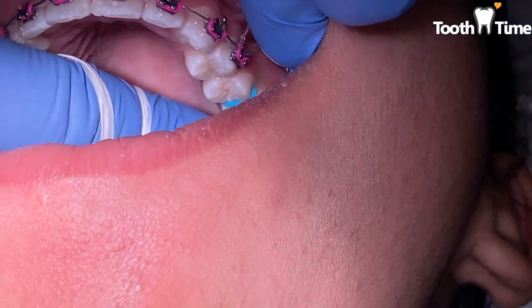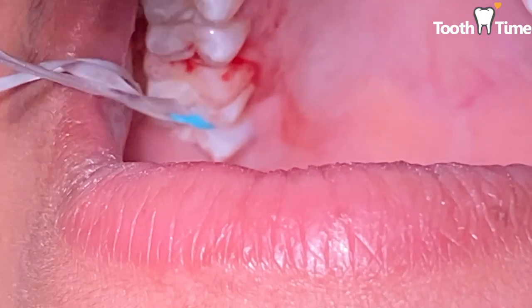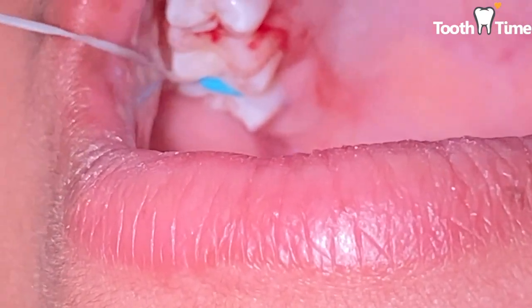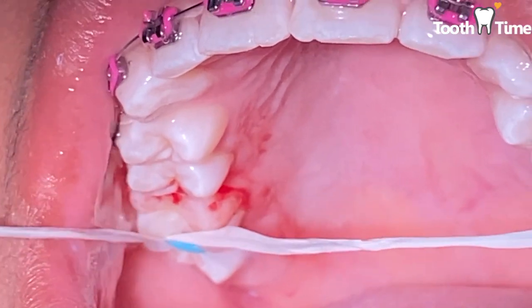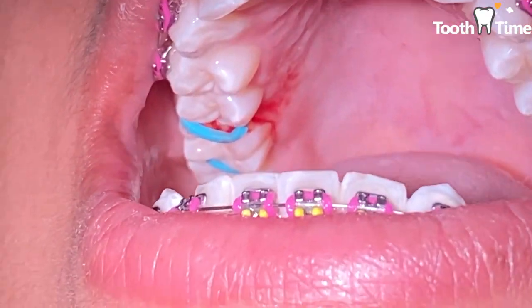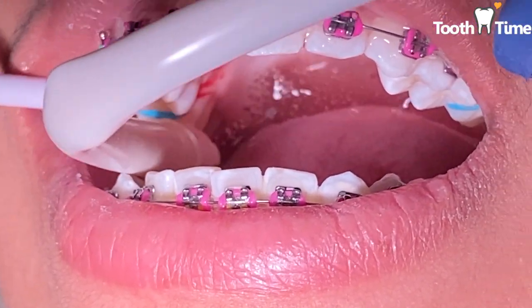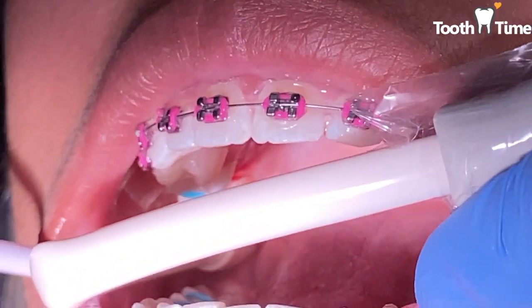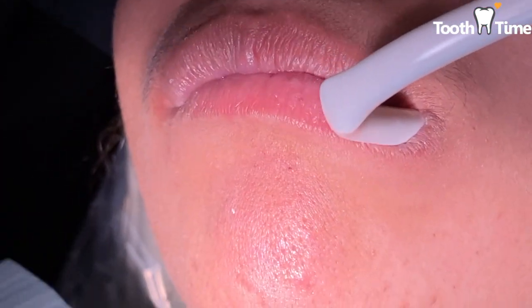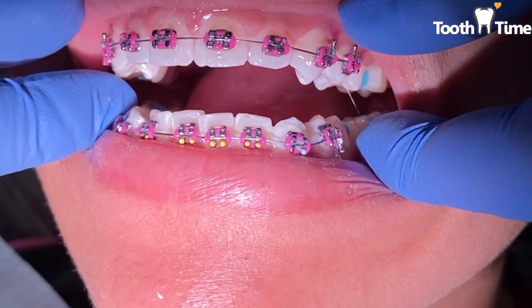Everyone says spacers are probably the most uncomfortable part of braces, so just take some Tylenol beforehand or right before bed. As you can see in this case we kind of struggled putting the spacers on her because her contact is so tight — this is a good example of why we need that space to place those molar bands. It'll feel like you have meat stuck between your teeth, creating pressure on your gums, and if we're not able to put those rubber bands in it's hard to place the molar bands.